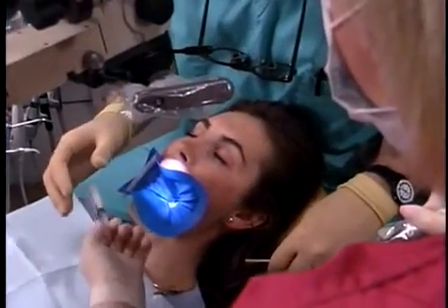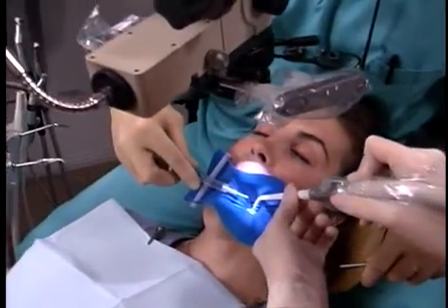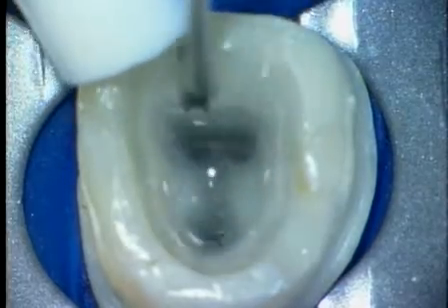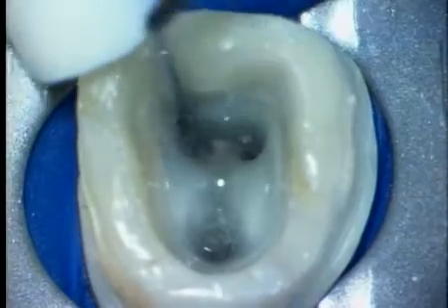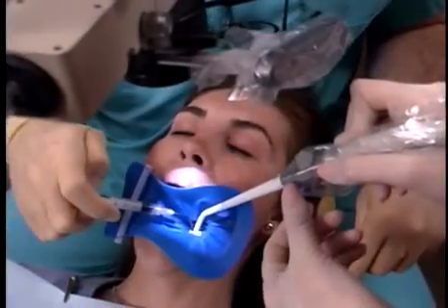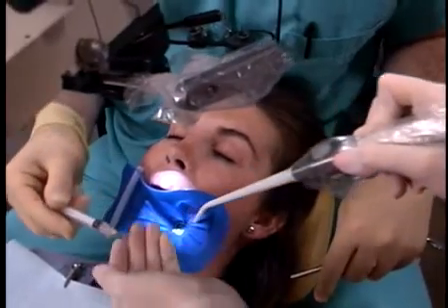The dental assistant passes the Irrigain syringe in with a cupped hand. The doctor holds the Irrigain syringe and always keeps it in motion when dispensing irrigant to prevent the needle from inadvertently locking up in the canal. Slowly injecting irrigant in combination with continuous hand movement will virtually eliminate sodium hypochlorite accidents.